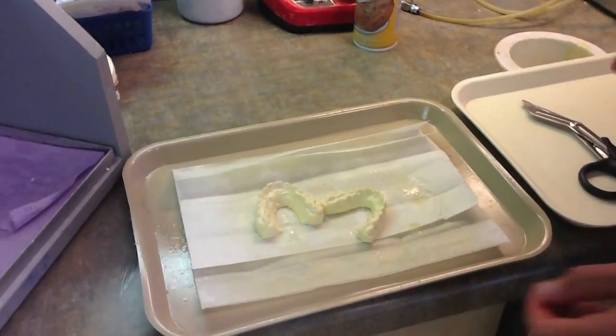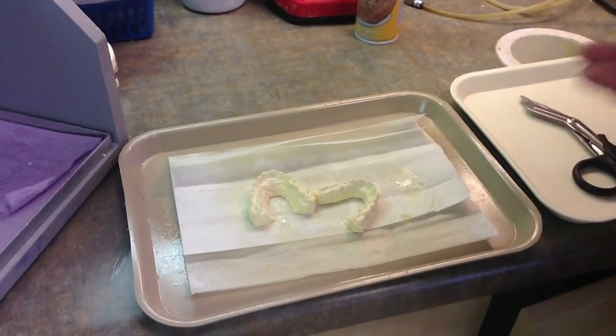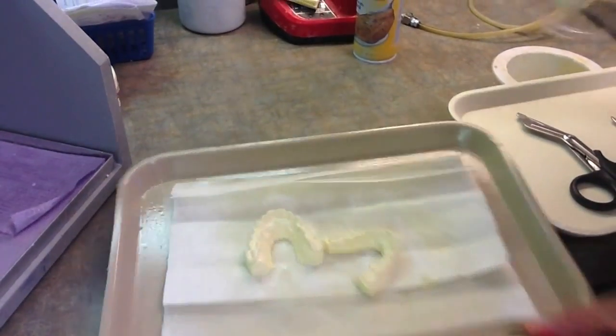Now these models are ready to go into the vacuum form machine — the Biostar or whatever you use to create the appliance.